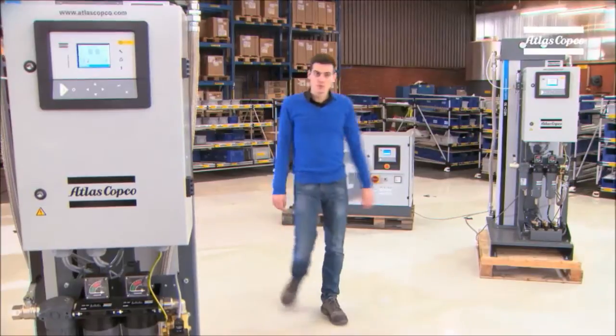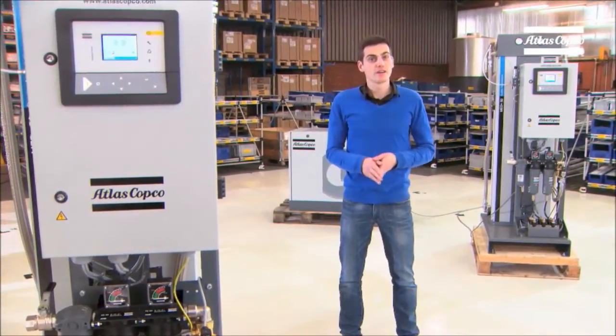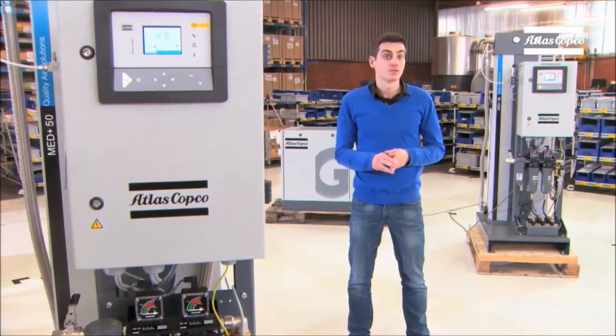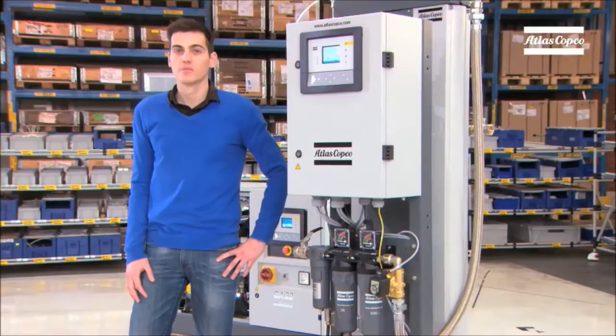You also need two medical dryers. We call them purifiers: one active purifier and another one as a backup. This provides the necessary redundancy to be able to cope with all unforeseen circumstances. With this in mind, we have developed our advanced medical dryer, the MedPlus.